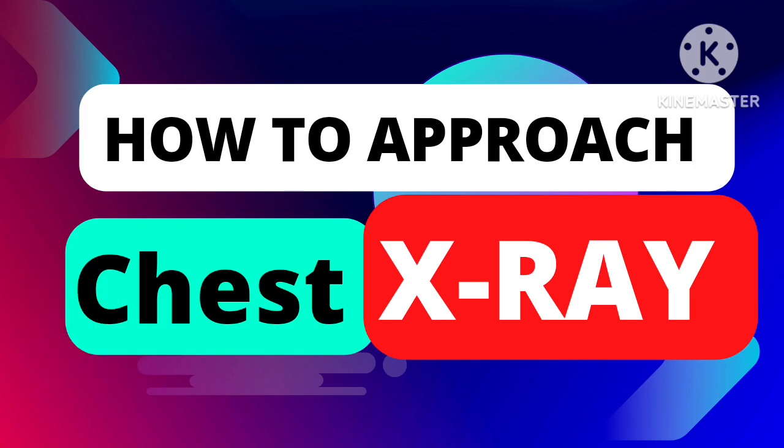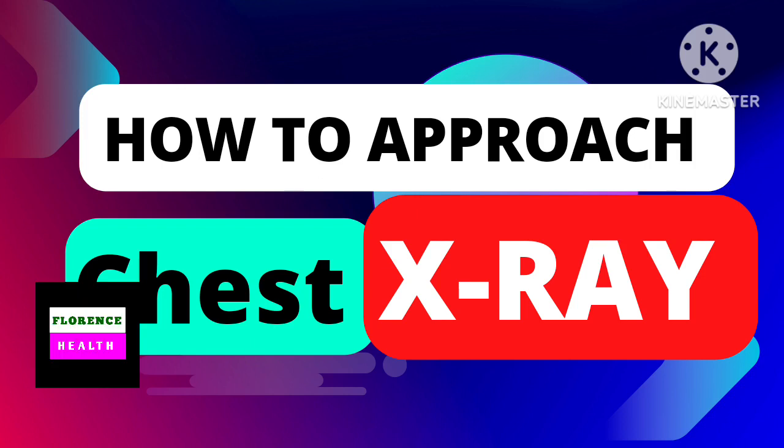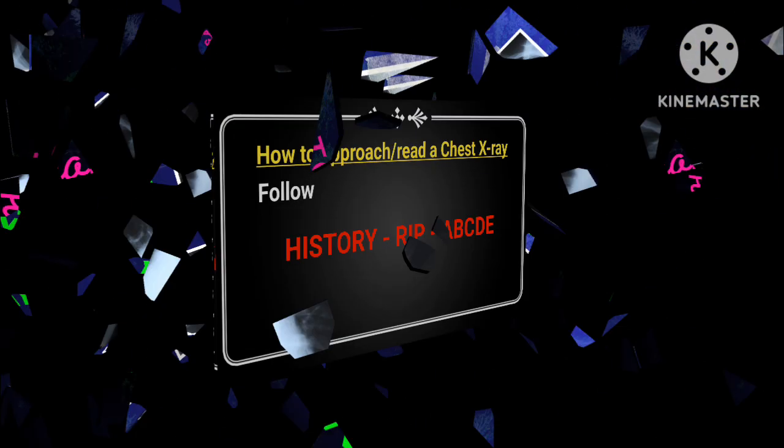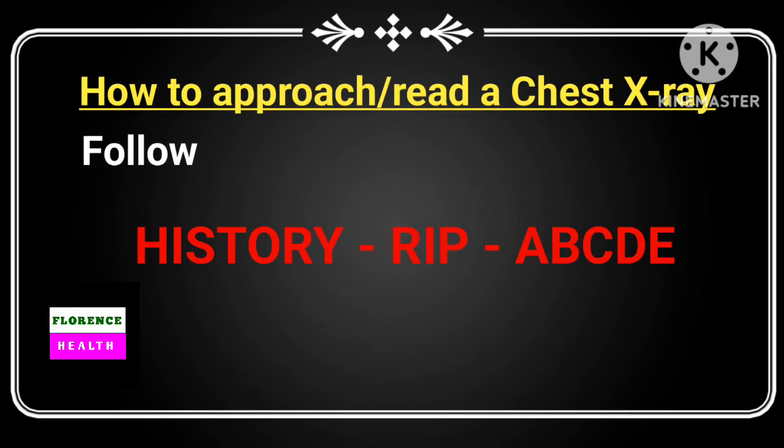Friends, today we will discuss how to approach chest X-ray in part 3. In total, for examination of X-ray, there are 3 sections present. You have to follow 3 sections. I have already discussed first 2 sections, that is history and RIP.